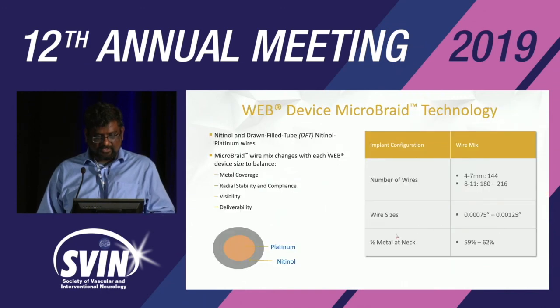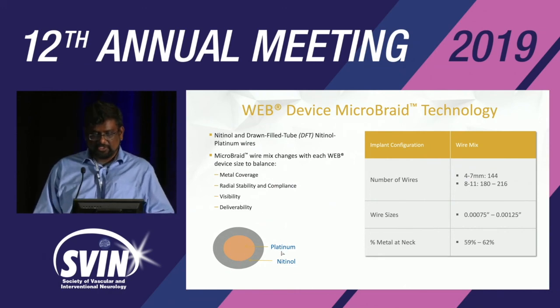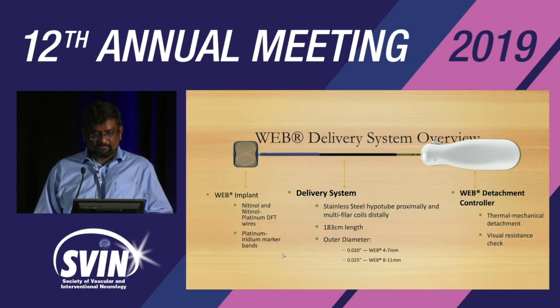We keep going. The wires are made of this drawn filled tube technology, so there's a platinum core to it, so it's a little more visible than what we used to have. This is the delivery system.